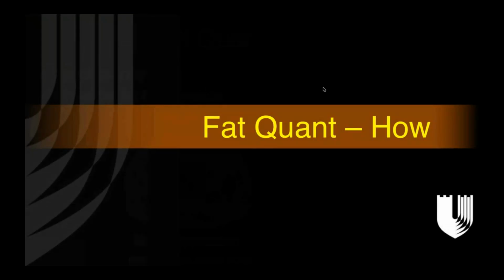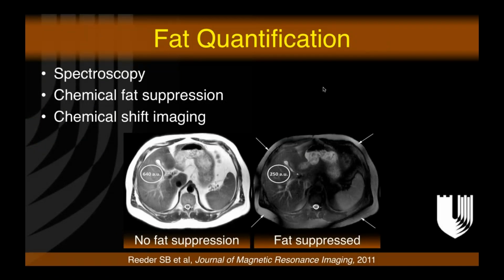Okay, so we're mostly done with the technical jargon. Let's talk about some of the practicalities. So fat quantification. Sorry, I got ahead of myself. We're done with the technical jargon for iron quantification. Let's talk about the technical side of fat quantification.